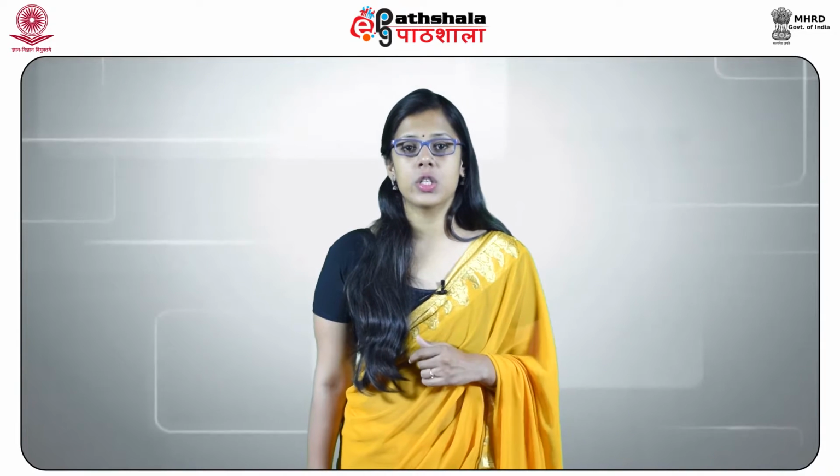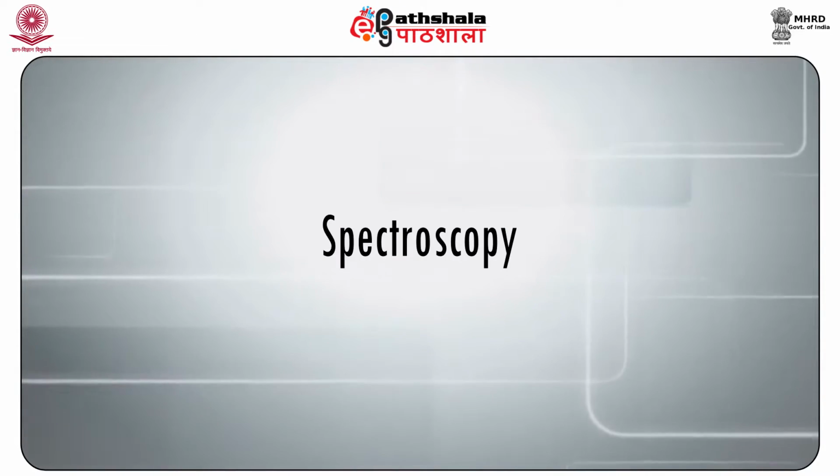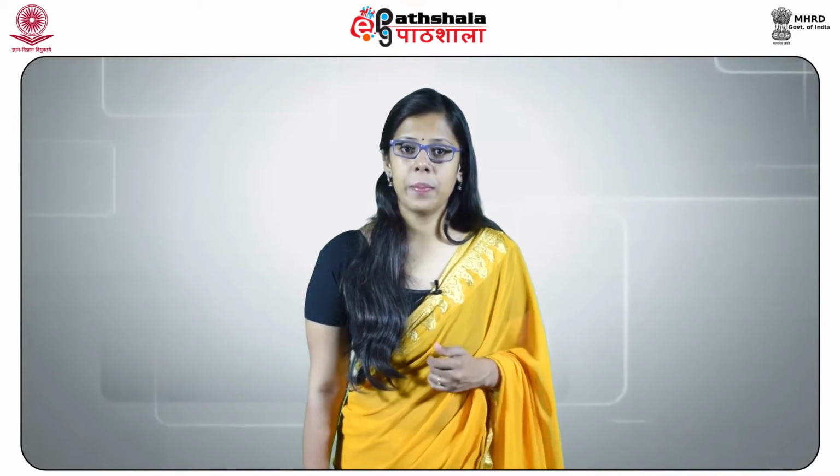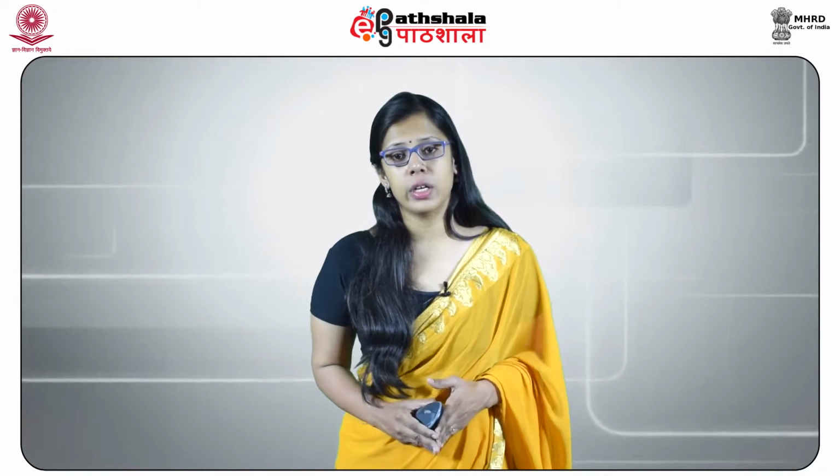Next we have chemistry and toxicology method, where we have spectroscopy. Spectroscopy is the study of interaction of electromagnetic radiation with the matter. It is the most influential tool accessible for the study of atomic and molecular structure and is applied in the examination of an extensive variety of testers. Spectroscopy methods are much more rapid and much less time consuming. They give information which is recorded in the form of permanent chart, generally in an automatic or semi-automatic manner.